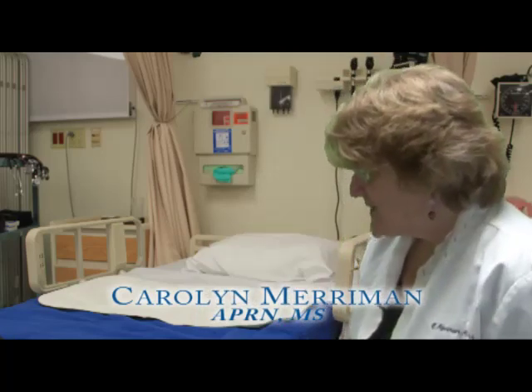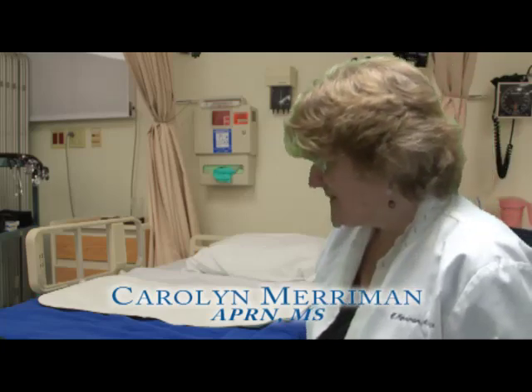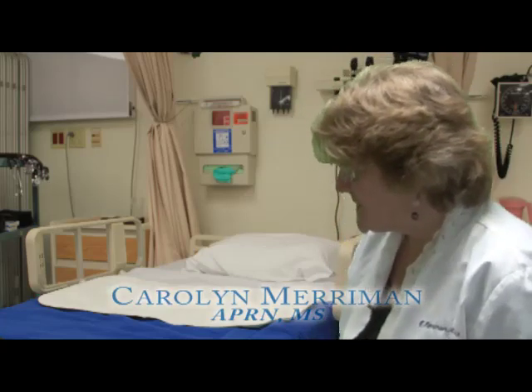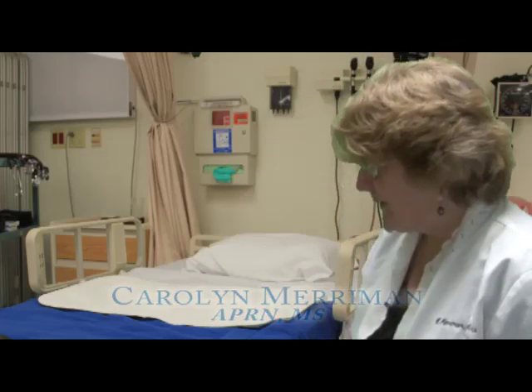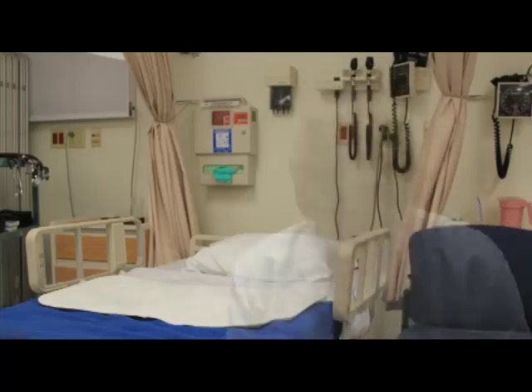This concludes our head, eyes, ears, nose, and throat exam. Is there anything I can do for you now, Ms. Jones? Nothing. I'm going to go wash my hands. Thank you very much.